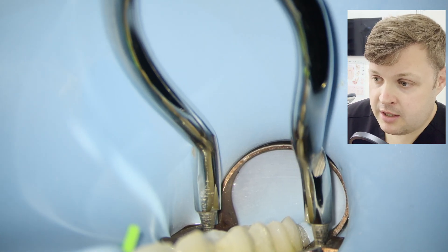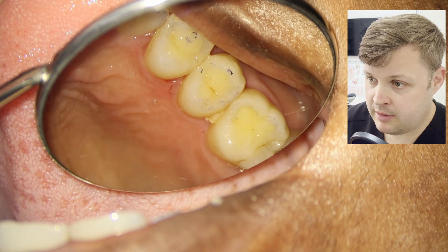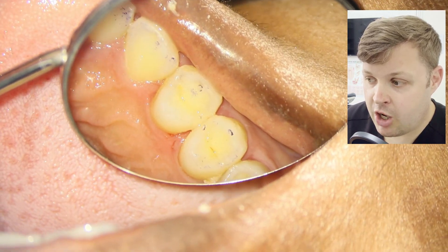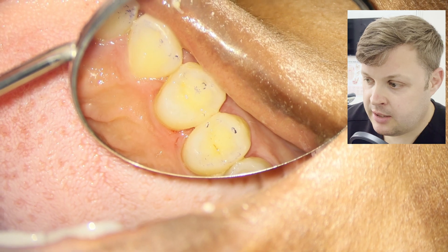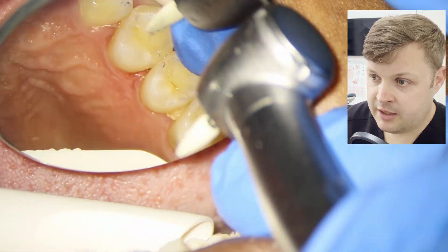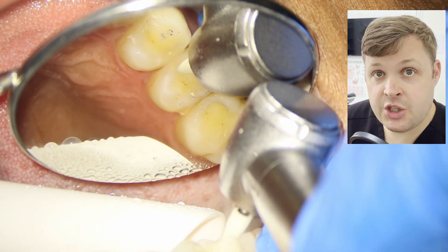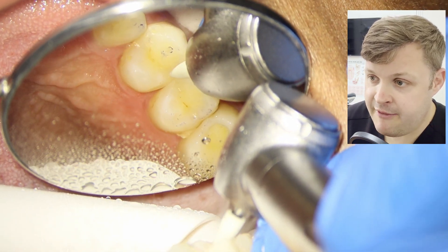We check the interproximal areas for any flash either side — looks like a really nice contact point. The final step is to remove the rubber dam and check the occlusion: get the patient to bite in ICP and laterally. The contacts are not too bad but the patient mentioned it felt slightly high, so we adjust ever so slightly and check the occlusion again.